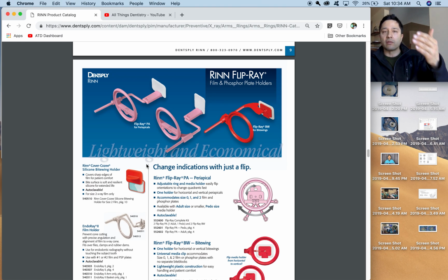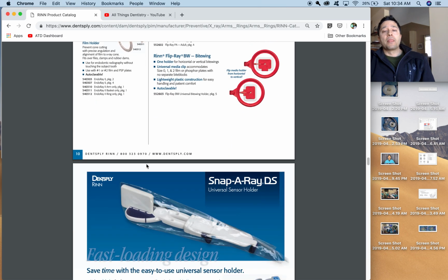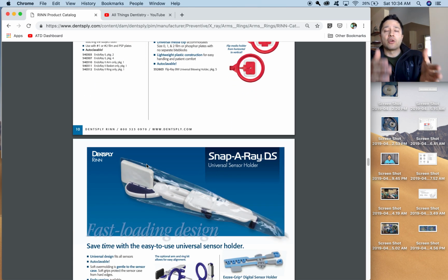I have the x-ray in what I think is the right spot, but I don't know where to put the tube. So the paralleling device was really good to give me an idea. Especially if you're using phosphor plates, you take the x-ray, then you have to run somewhere, develop it in the computer, and that might take 1 to 2 minutes, and then you come back and you look at it and you think, oh, I got to do it again. So you want to make this as efficient as possible.